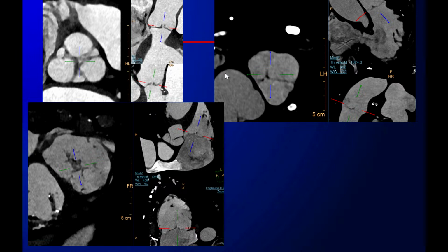And you can look at the pulmonic valve, which is not always easy to bring all three in the plane, and there's some mild thickening, and the TR probably is very small as well. All those are important for you, so you have the images, you can hone your skill by evaluating and looking at them.